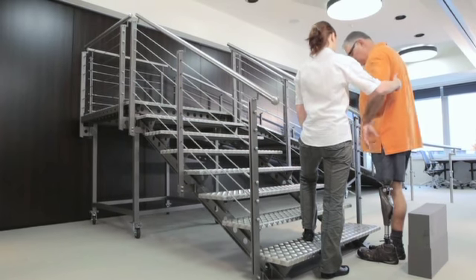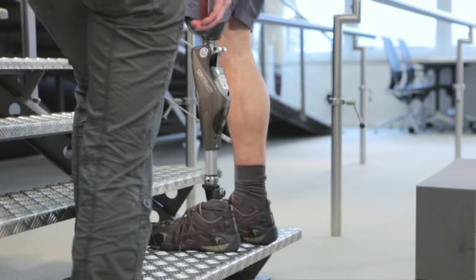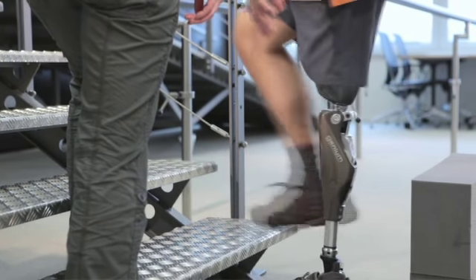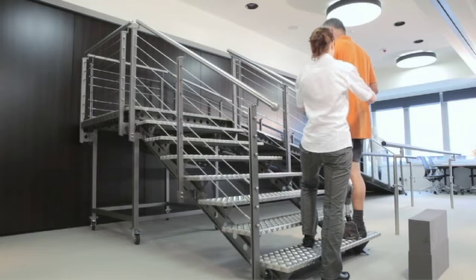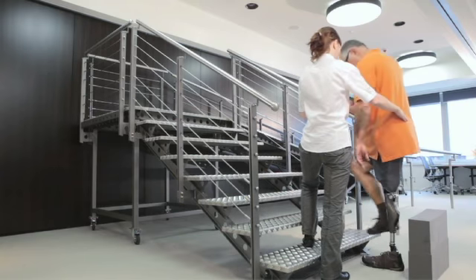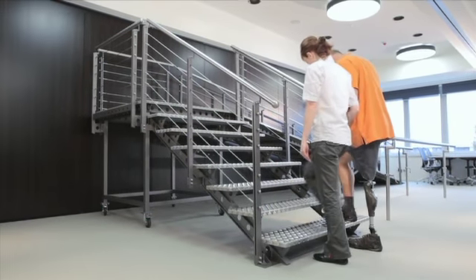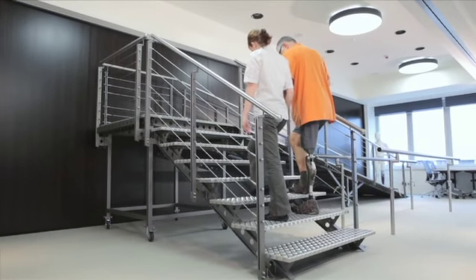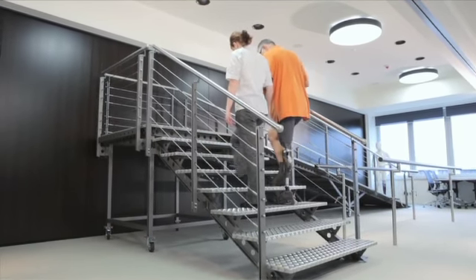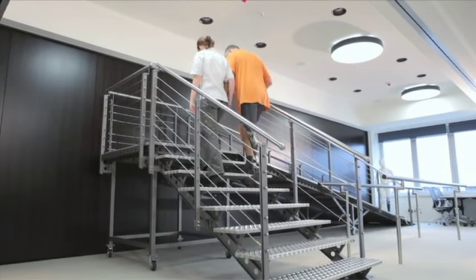The user stands in front of the lowest step. The foot needs to be placed firmly and completely on the step. As soon as the user loads the flexed knee, he needs to extend his hip. Important hints for users when walking upstairs are: use a handrail to help prevent rotation of the socket, as well as to add confidence and to assist in ascending the stairs.